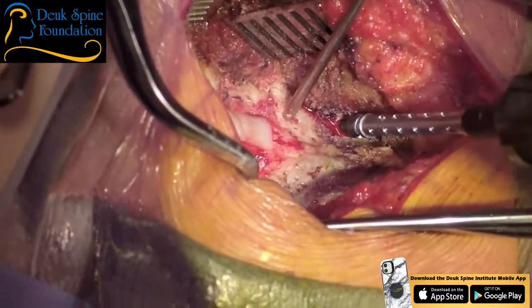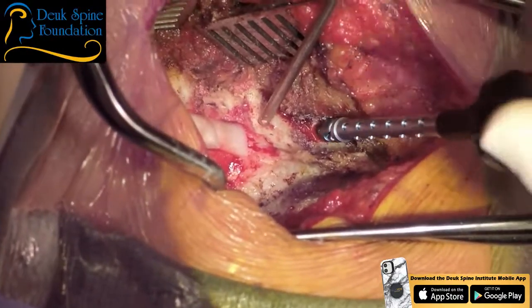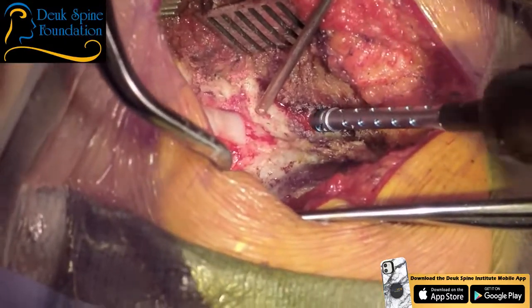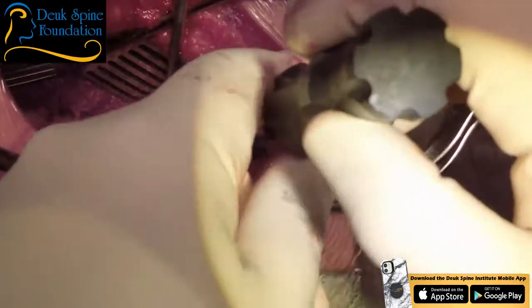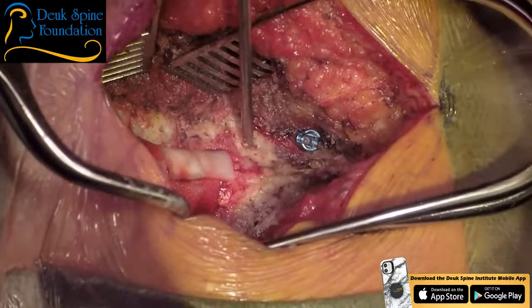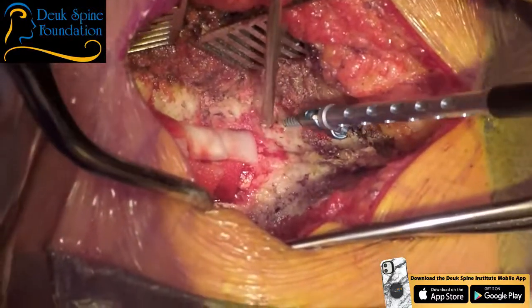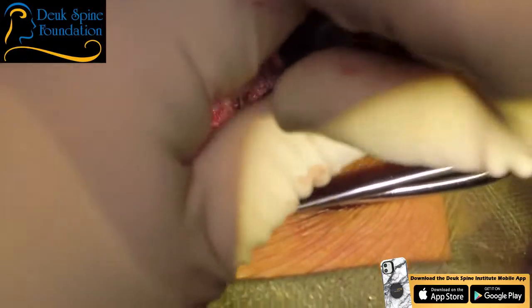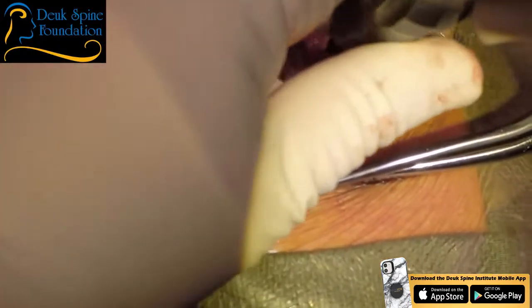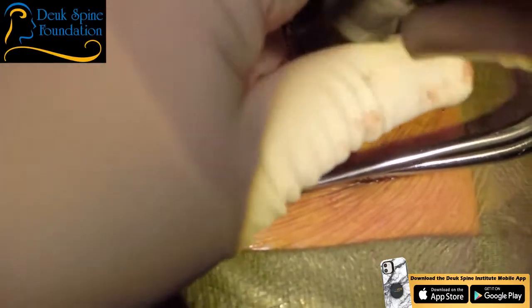If you don't get the pedicle, it's okay. I've never had a problem with it. But you don't want to get the spinal cord. That would be very bad. Okay? So if you don't get the pedicle, you've basically got a transverse process screw. And it's bicortical. And it's fine. It's not the end of the world. I've never had a junctional failure as a result of it, okay?